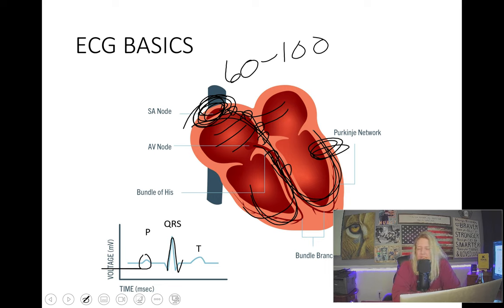When they cross the cell membrane, we have wires on the chest, right? We have a little gel. The gel is against the skin, and then you have a wire hooked up to that. And that transmits that electrical impulse over to a device that can record it, and it'll show waves, right? You go, oh man, that's pretty cool. Somebody was really, really smart. Some electrical engineer was super smart to be able to figure that out.